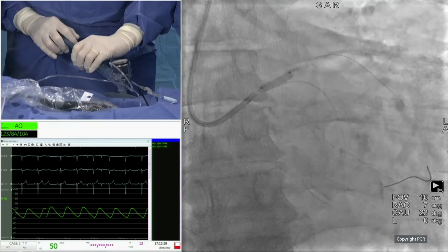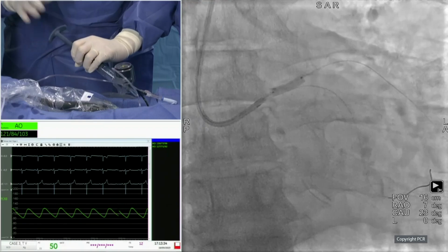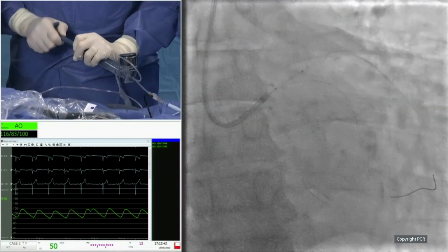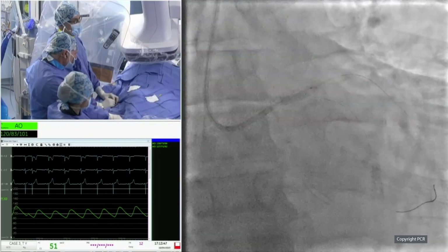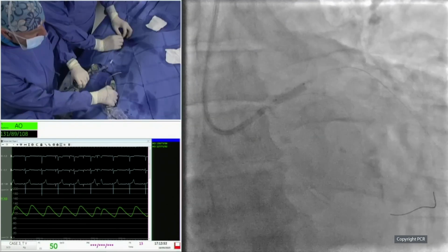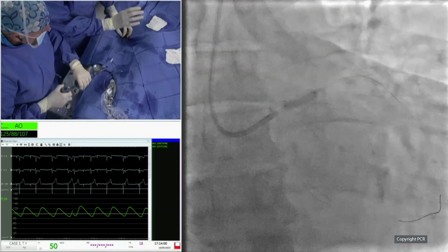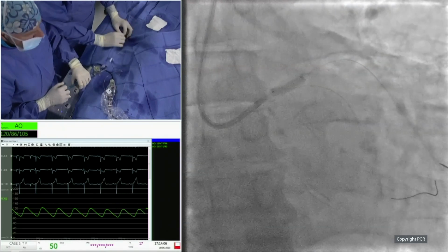You can see you suspect on fluoroscopy the calcium at the upper part of the balloon now. And you see that the balloon is pushing a little bit the calcium. So we have done already 4 cycles. We could perform 2 cycles more. We could discuss what to do in case of decrease in the pressure, and if the patient does not tolerate the inflation of the balloon in the left main, we could divide it at 5 pulses and deflate the balloon and not deliver the 10 pulses for the patient.